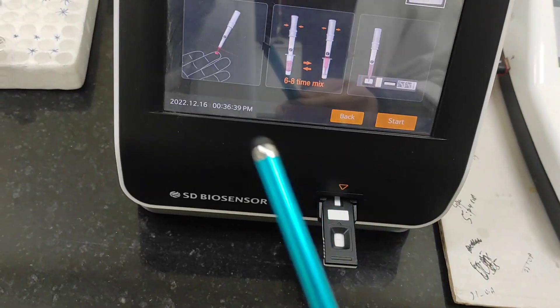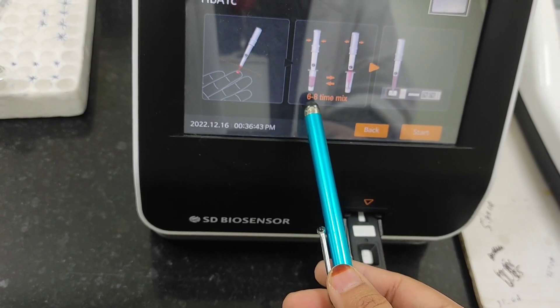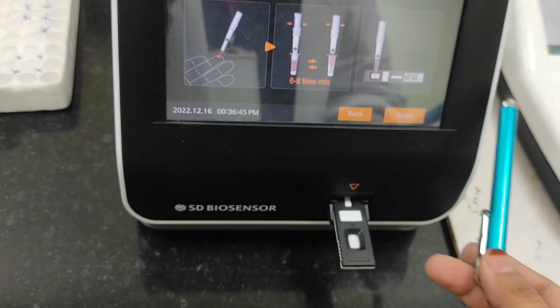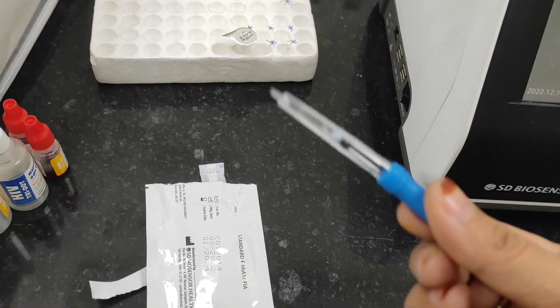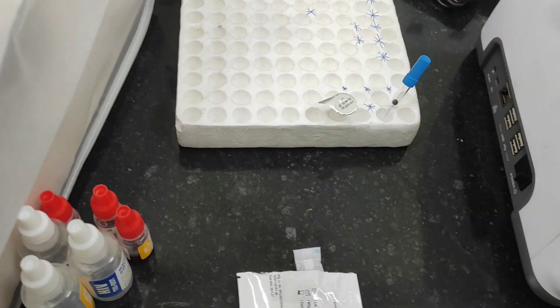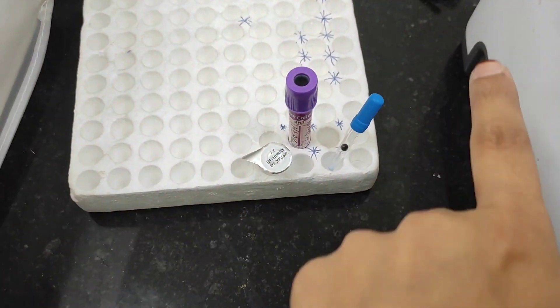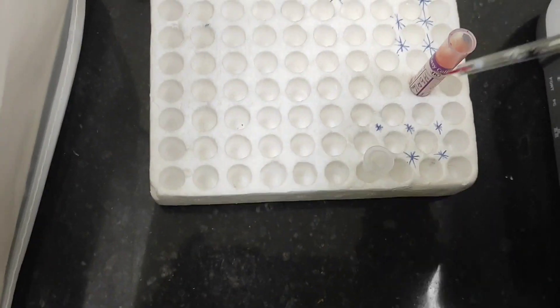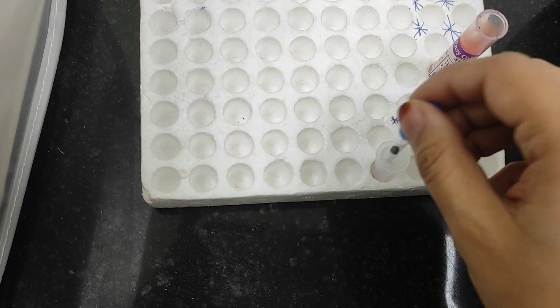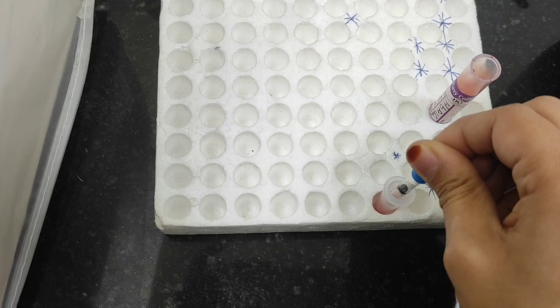As you can see on the display, it says to mix six to eight times. We'll take whole blood for performing the HbA1c test. This here is the HbA1c sample of the patient, and this is the dropper — we'll take the blood sample with the dropper.